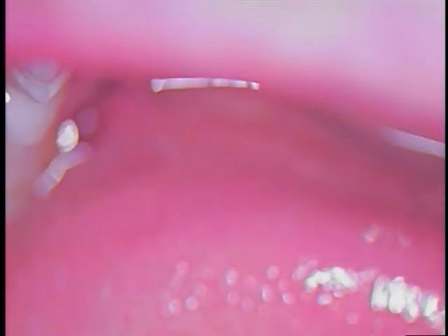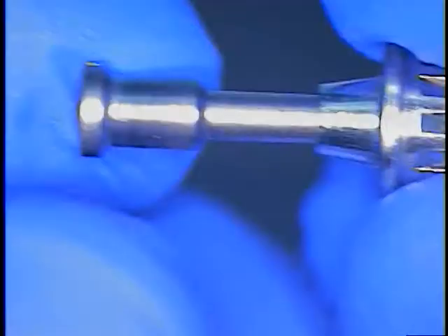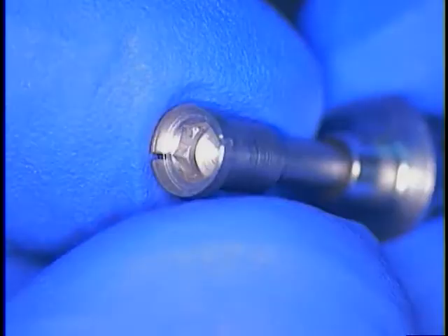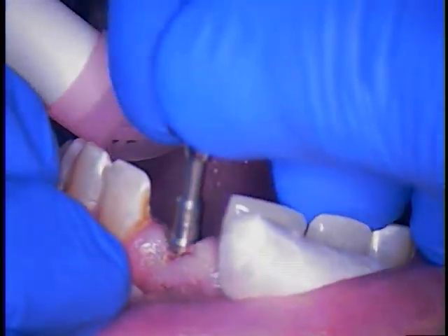Here we go. Time to get that out, so we'll switch now to a different driver. This one is going to be part of another case that we have, so I'm just going to take it out. We'll put it right back in. Same container, I'll save that. This one takes a handheld socket, or a handheld driver handle. And this way we can go in and actually unscrew that. And it should come right on out with the driver. And then we'll measure what's there.